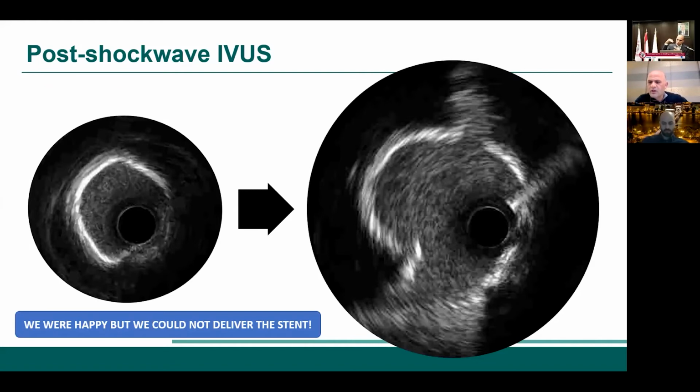We had our guideliner there, and whatever you do to modify to get the stent to slide on that calcium chunk, that minimal lumen area, we couldn't. We could get the balloon, we opened it, but for some reason, because of the morphology of the calcium and the chunk itself, we were still facing trouble getting the low profile stent we've been using.